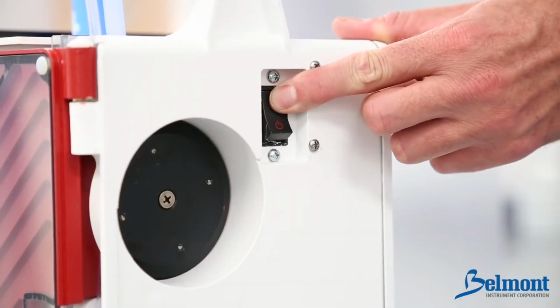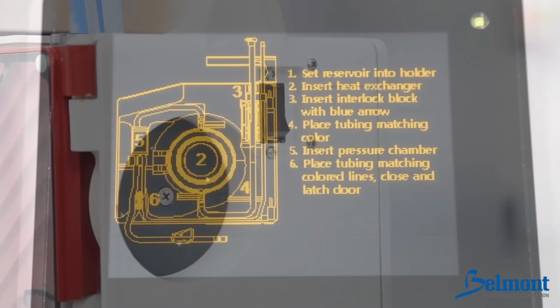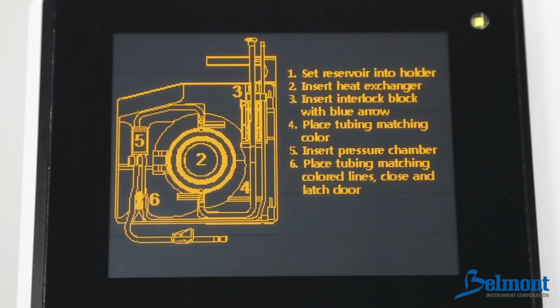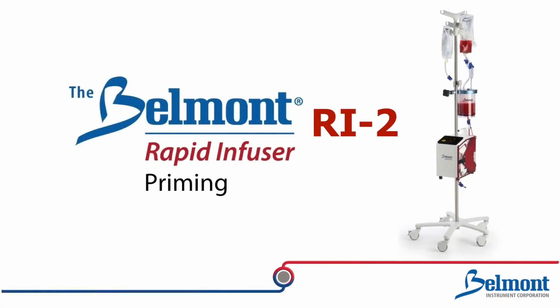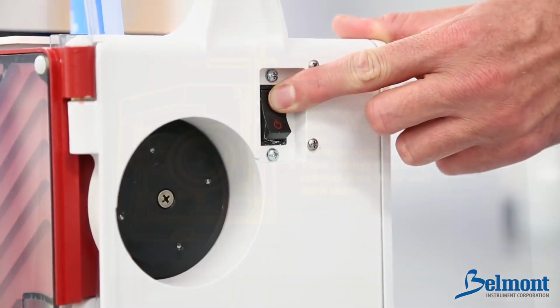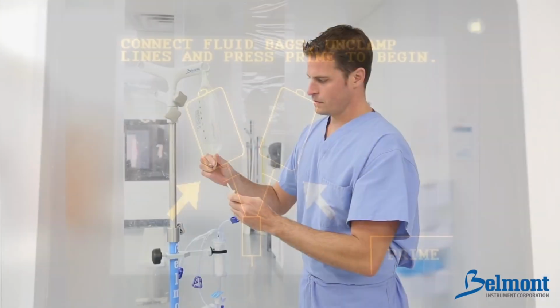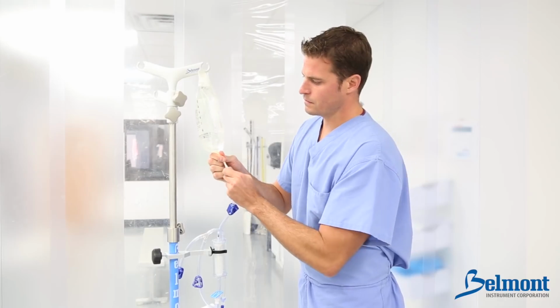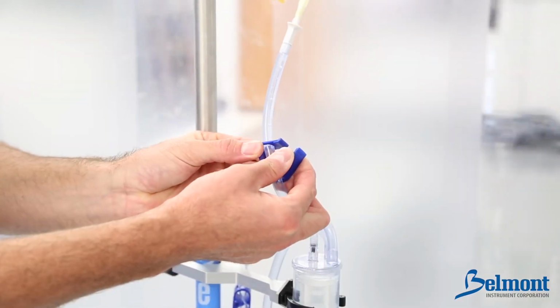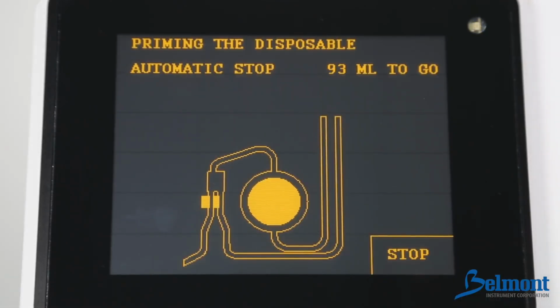Press the power button firmly to the on position, which is located on the back of the device. After a brief self-test, operation instructions will be displayed on the screen. When first switched on, the screen will display instructions for installing the disposable set. Press Next to move to the prime screen. You will now be instructed to connect fluid bags and unclamp lines. When ready, press Prime to begin priming the disposable circuit.